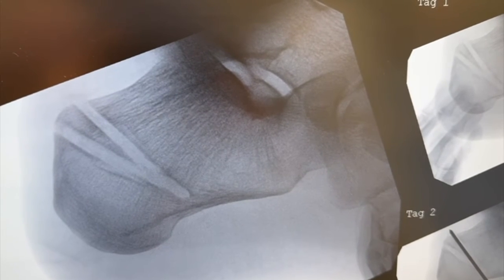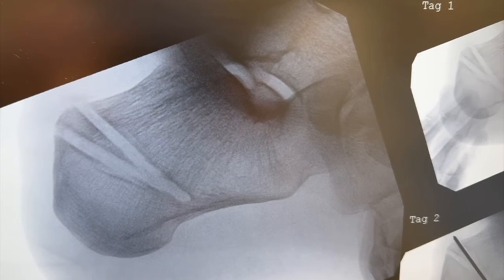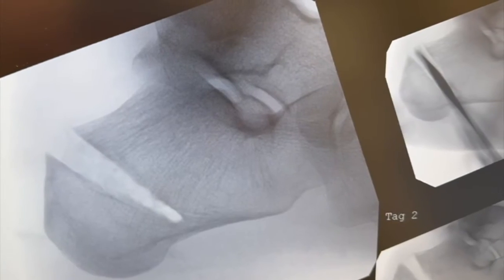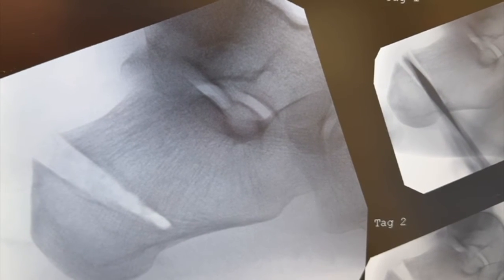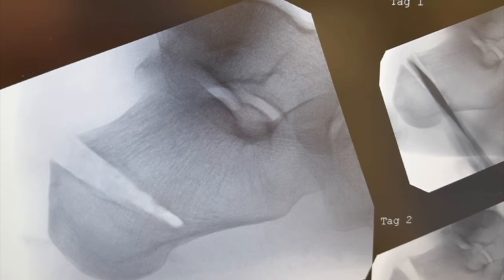I'll now use a combination of hemostat and pituitary rongeur to remove that intervening bone wedge through the edge of the site. We've now removed the intervening bone fragment, and we're going to close down the calcaneal Zadek osteotomy with dorsiflexion of the ankle.